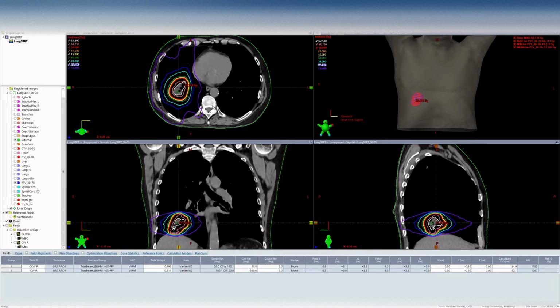And then there's another conformity index called the Paddick CI. The R100 tells you the ratio of the prescription dose to the target volume, but it doesn't necessarily tell you where that volume is. There's no location built into the calculation. It's simply the volume of the 100%. That volume could be anywhere inside the body, or that dose could be anywhere in the body. So if a portion of it is outside of the PTV, then you won't get that from that calculation. Technically you could have a value of 1, which would be a perfect CI or R100, but if you have half of that volume outside the PTV, you wouldn't know it.